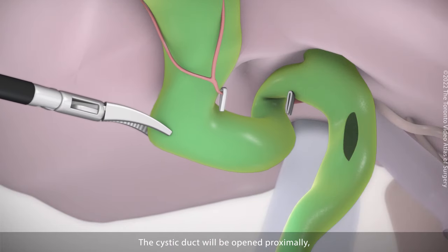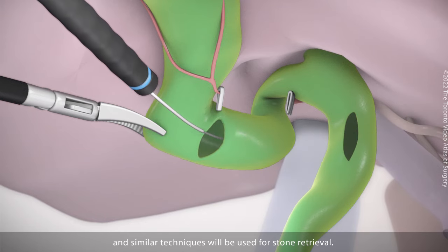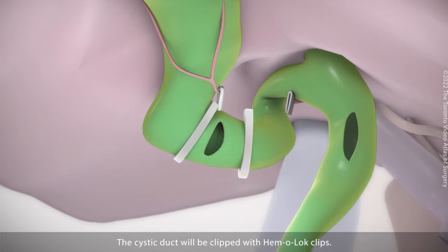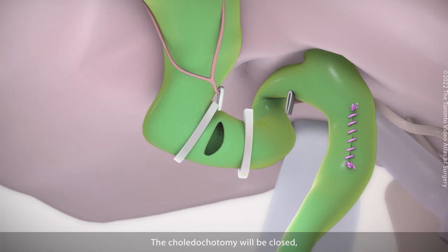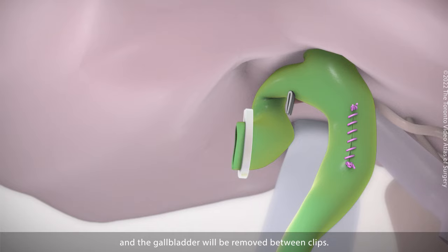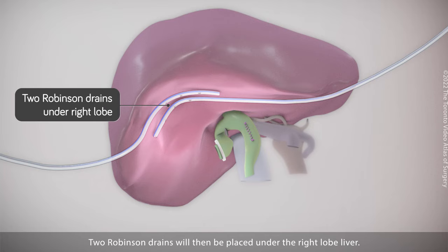The cystic duct will be opened proximally and similar techniques will be used for stone retrieval. The cystic duct will be clipped with hemoloc clips. The choledocotomy will be closed and the gallbladder will be removed between clips. Two Robinson drains will then be placed under the right lobe of the liver.